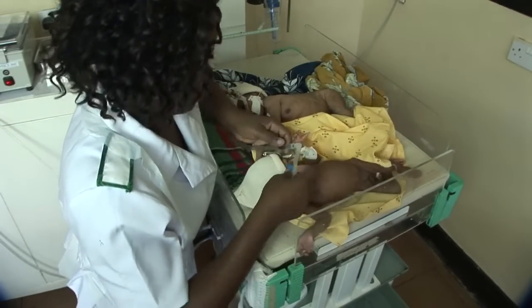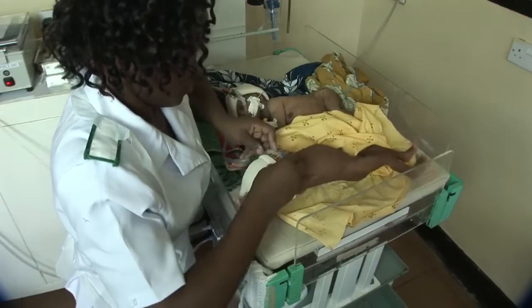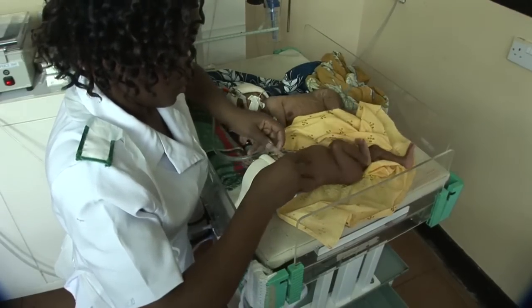Putting a real baby on C-PAP is sometimes a little more challenging than a doll, especially if they are moving around a lot.